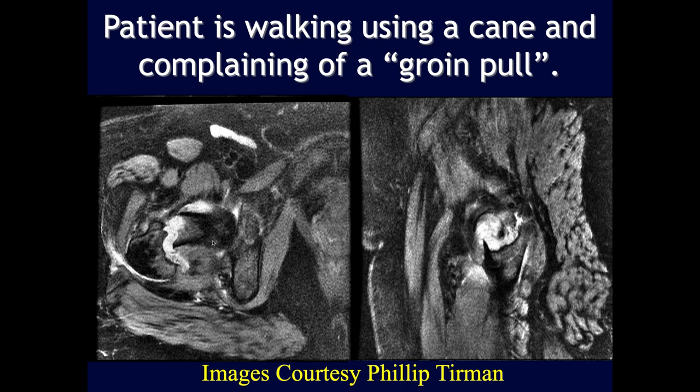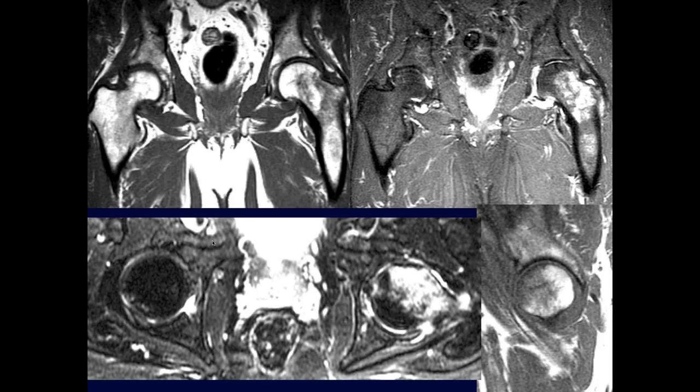Yeah, you can put in a prosthesis in this case, especially if the age is right. You could also pin it, but pinning this one is not as stable and as happy a result as putting in a prosthesis. I sleep better if I put in a prosthesis in this case with a long neck.